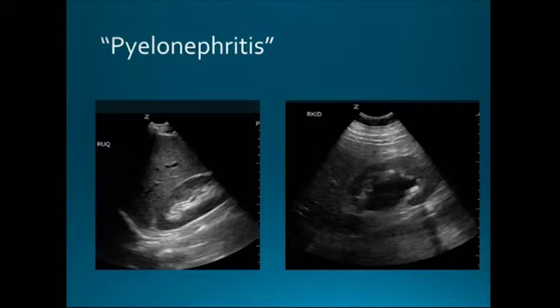And so why was she febrile? Why was she looking poorly? Well, she had infected, obstructed kidney stones. And so what do you do with people who have infection? You got to get good source control. You got to relieve that obstruction. She was about to be discharged. We called the urologist to say, hey, she's got this obstructed stone. She really can't go home. We need you to come in, relieve the obstruction. She's not looking good. He was like, get a CAT scan.